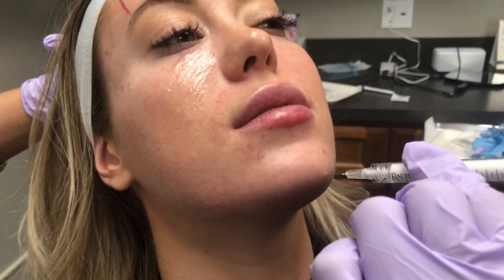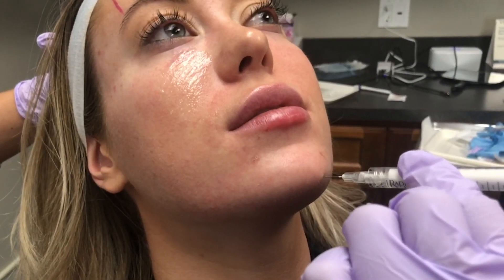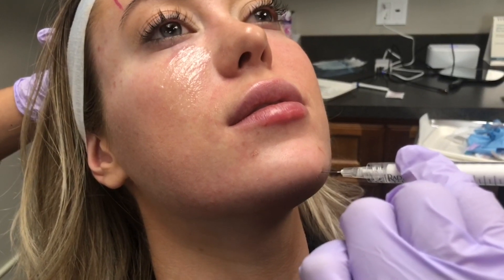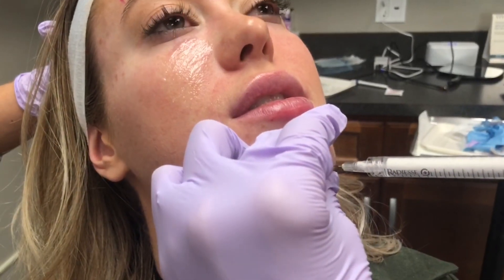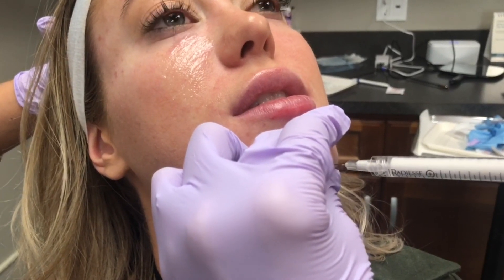We are going to sculpt the most beautiful chin on this lovely patient today. You can see here the injector is using a white filler. That white filler is called Radiesse. It is calcium hydroxylapatite.